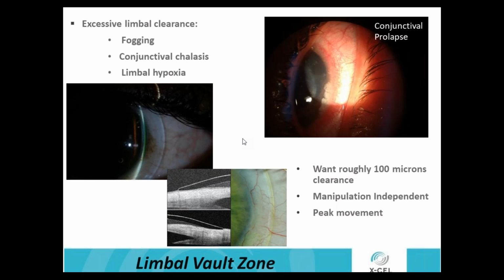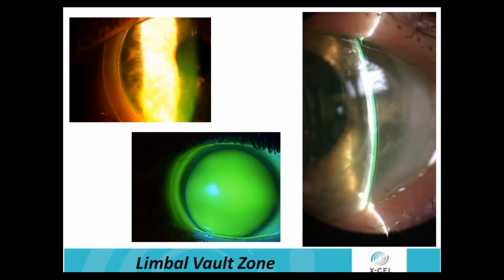We don't have to get into that, but it is another function of that. So you can see if I have that limbal bearing, this absence of fluorescein around that limbus, I can just control that area and increase my zone where I have that bearing.